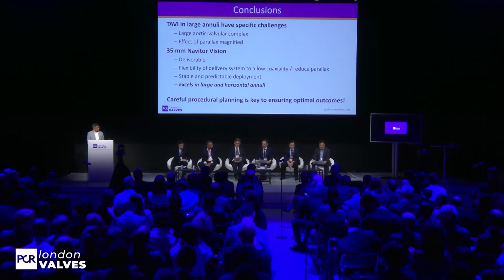Thank you so much. Excellent demonstration and excellent outcome. I have a really easy question. How relevant is it in your practice to have a large self-expandable platform like Navitor 35, which is so easy to implant? What percentage of patients do you expect to treat in Australia, for example, with this device?